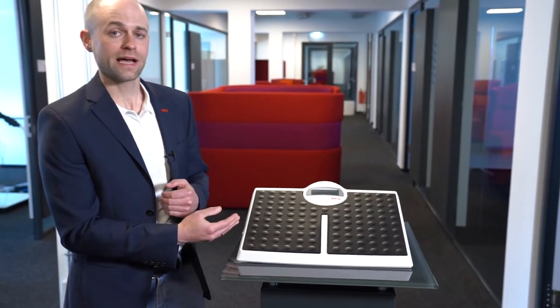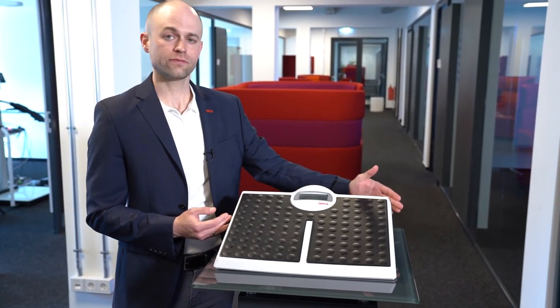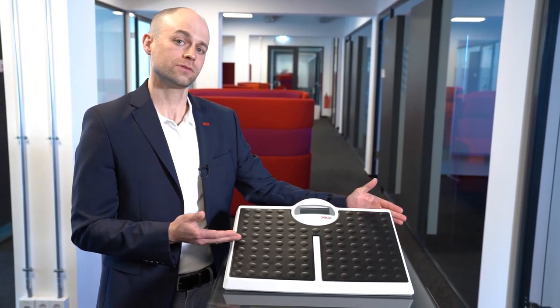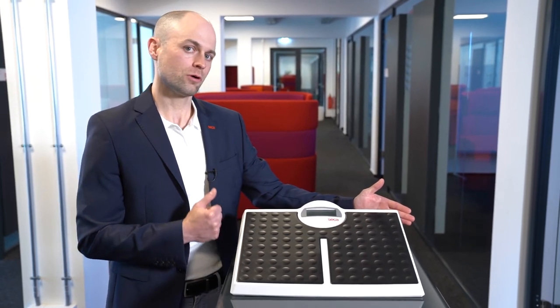It features a high capacity of up to 440 pounds or 200 kilograms. It also has a nice wide platform, low profile, and a rubber-coated matting that makes it easy to get onto and stand on. It also features Bluetooth connectivity, the standard for remote patient monitoring today.